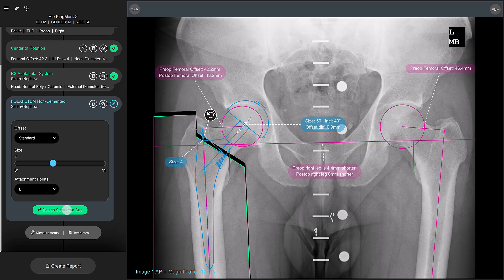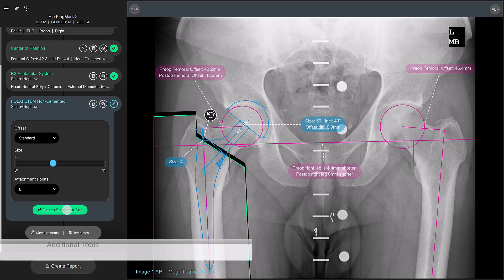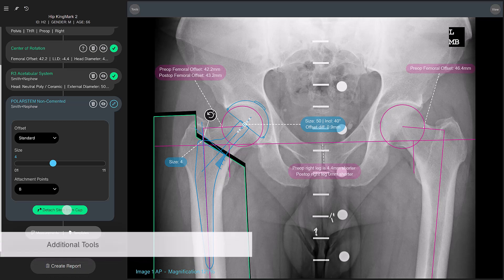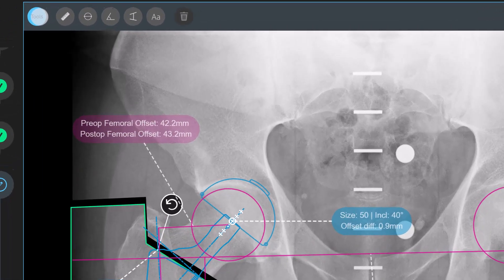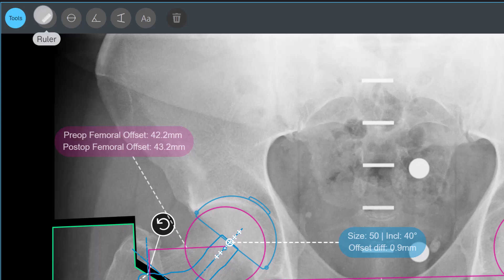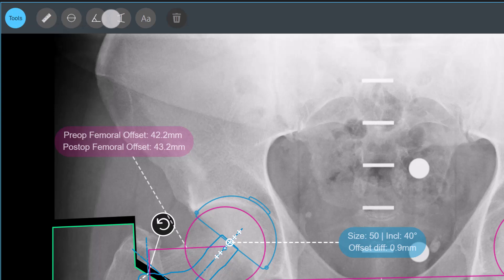In addition to the main workflow tools, you have a set of simple tools that you can access by selecting the Tools button at the top left of your images. These tools can be useful if you find yourself wanting to add extra measurements and annotations to your planned images.